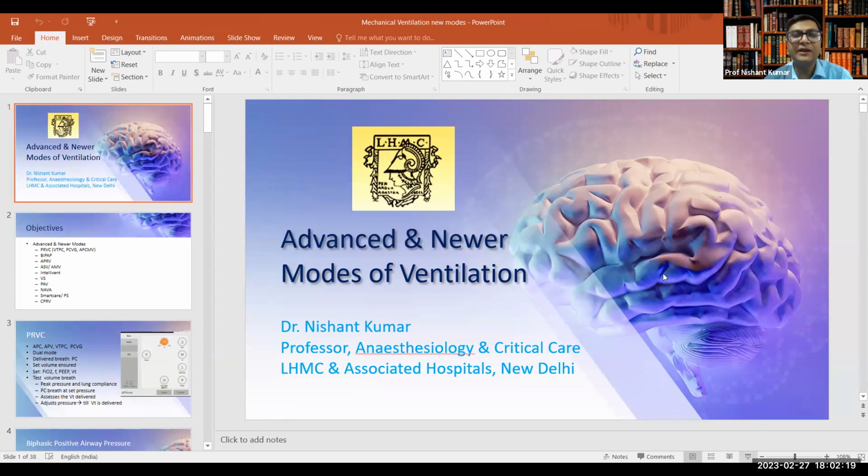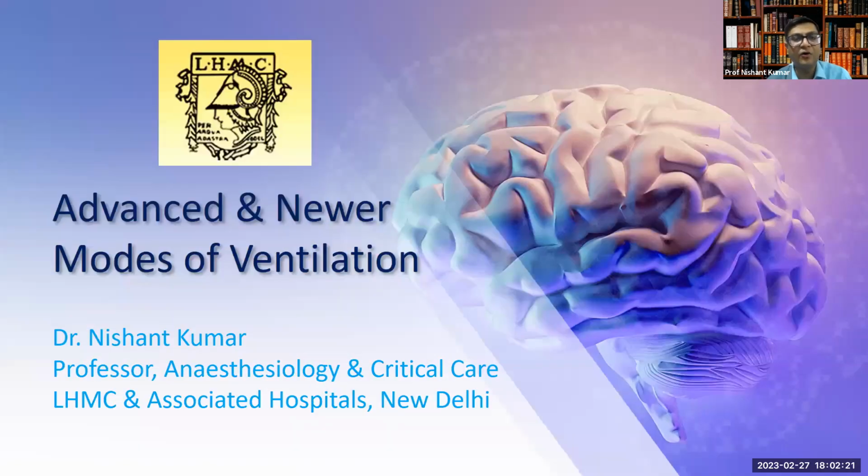Yeah. So the thing is that these new advanced modes have come up, which have a mind of their own. And it is not what the operator has said, but they can gather feedback from what the patient situation is, the lung compliance, resistance, saturation, EtCO2, and can apply all that knowledge and guide the operator, or in fact, even take over the ventilation themselves within the set targets. So that is now the advent of AI in the realm of mechanical ventilation.